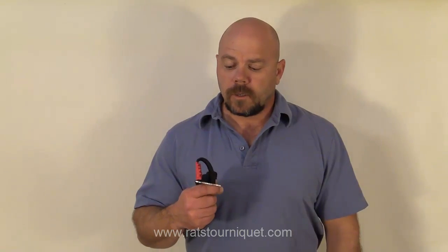Hi, I'm Jeff Kirkham, the inventor of the Rapid Application Tourniquet System, or RATS, the most effective and fastest tourniquet system on the market.